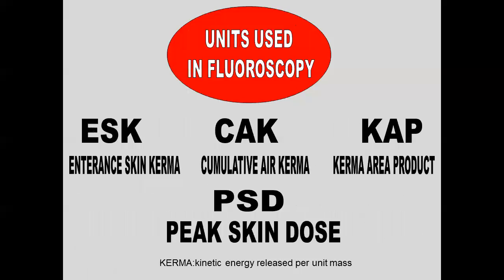Now with these, we look at what's your entrance skin kerma. So how much radiation was there at the entrance beam to the patient? For us in the cath lab, on their back, how much radiation was at the entrance?